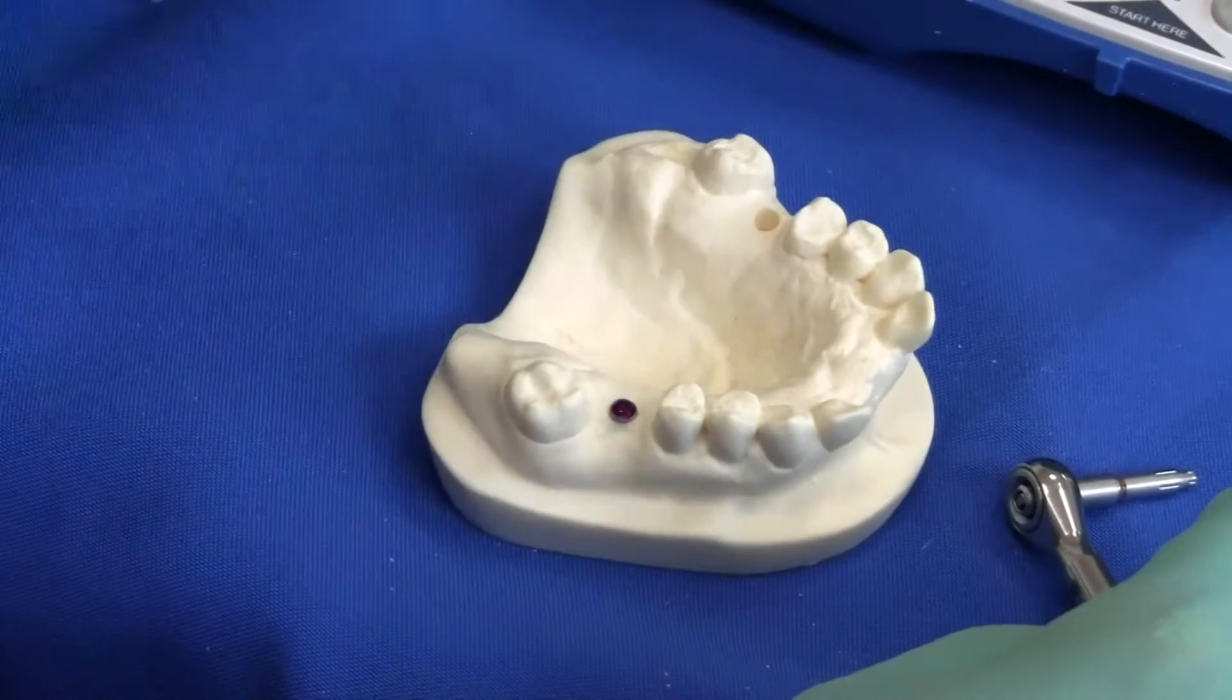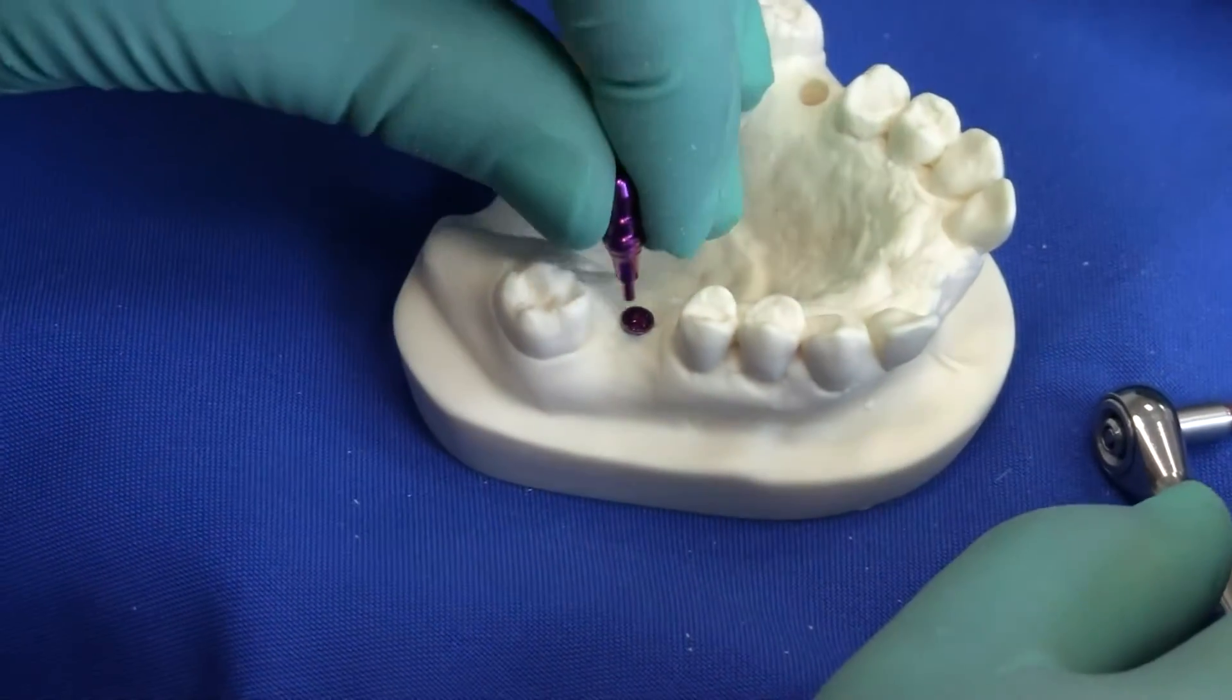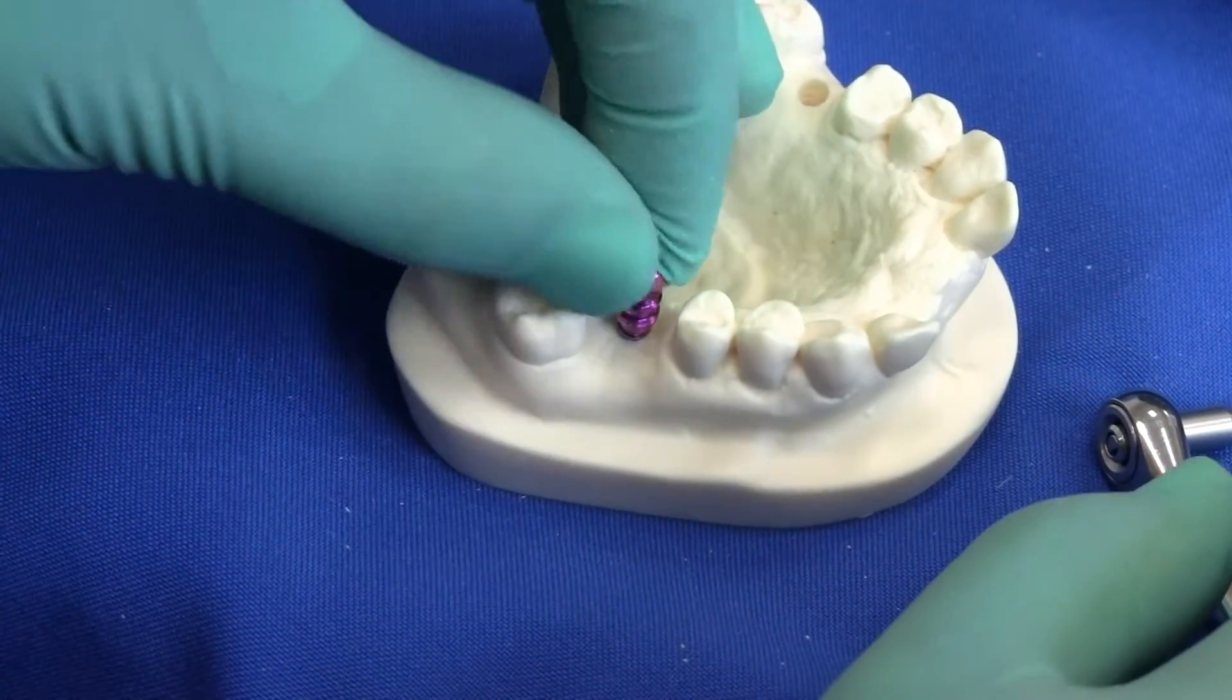I can check the implant's angulation using our direction indicators. Snap right into the implant.